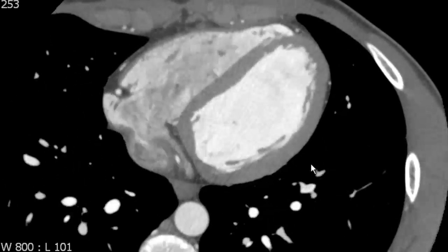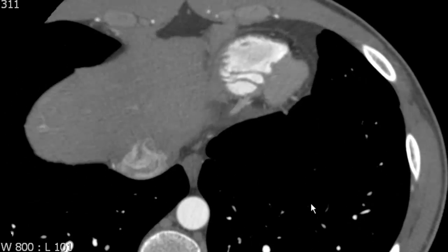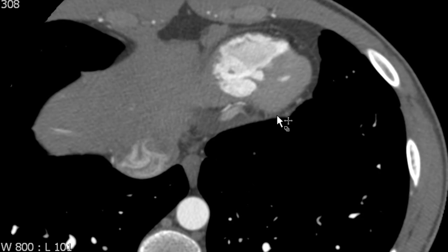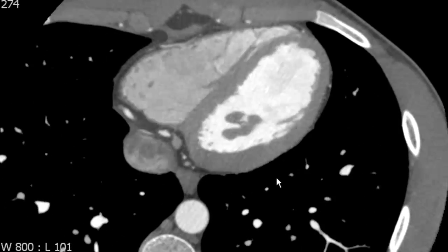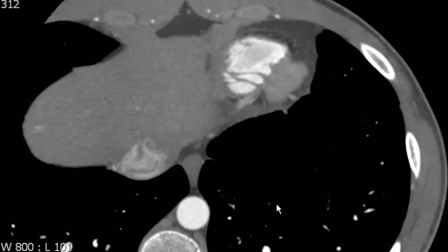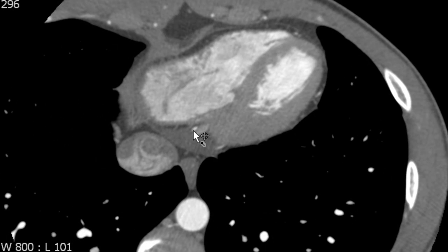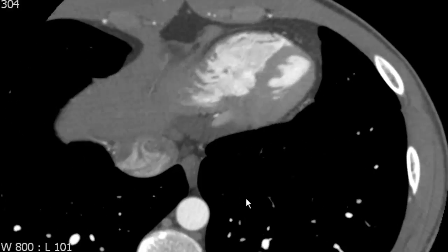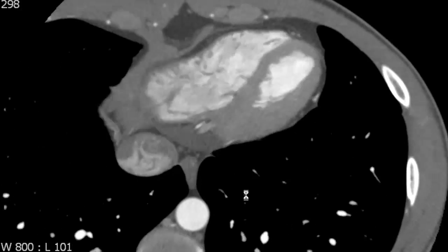The sulcus continues along the anterior surface of the heart around the apex, and then we can see that there's another sulcus — kind of an upside down gull wing contour on the inferior surface of the heart. This is the inferior interventricular sulcus. We can see that there's a blood vessel that lives in this sulcus on the inferior surface of the heart — that is the posterior descending artery.